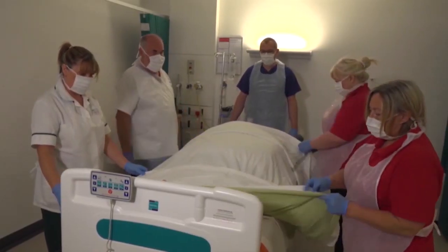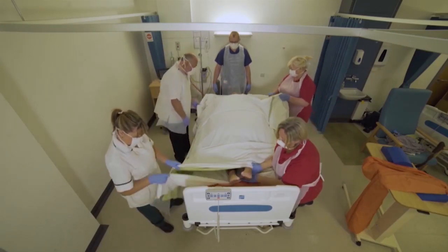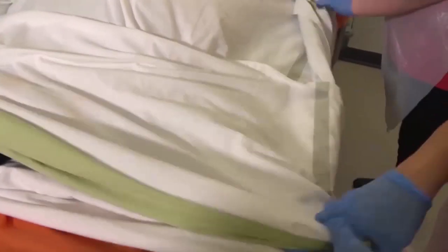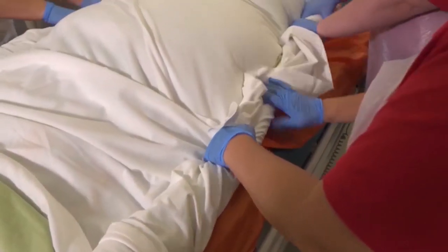Now what we're going to do is we're going to get all three sheets. Just take that under the heels. There we go. I'm going to roll all three sheets up, very tight.